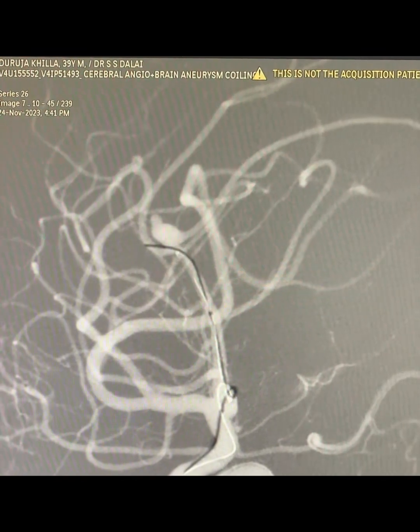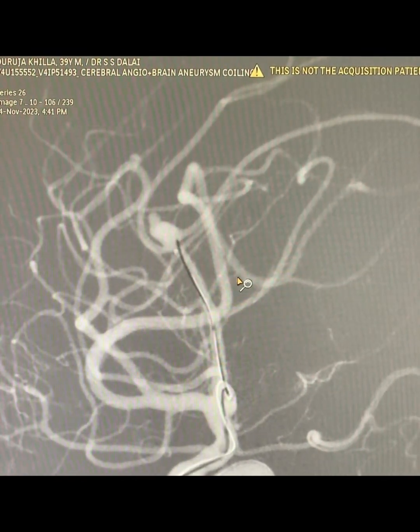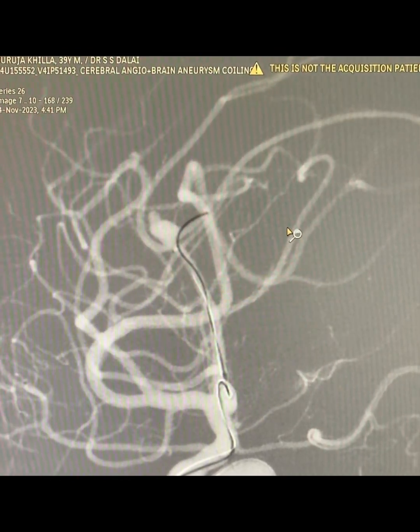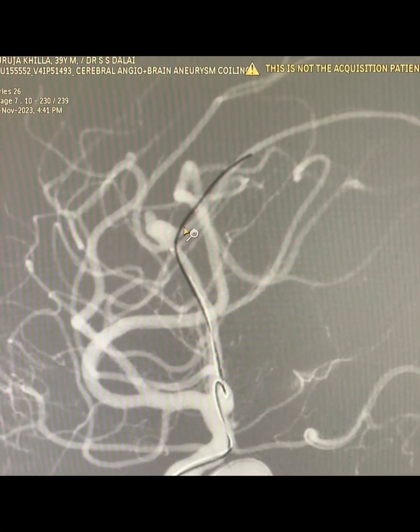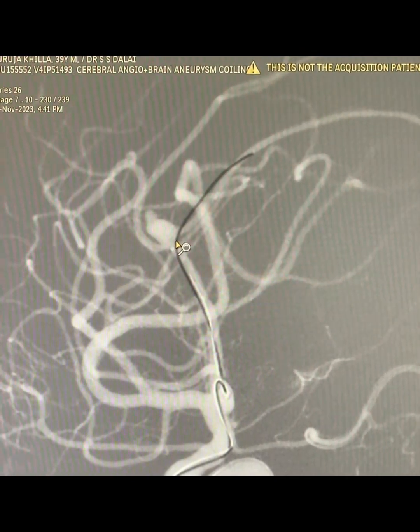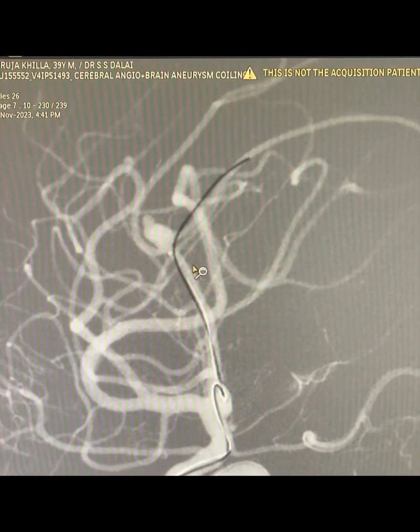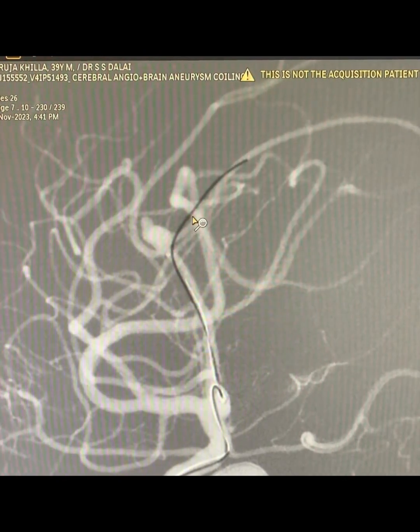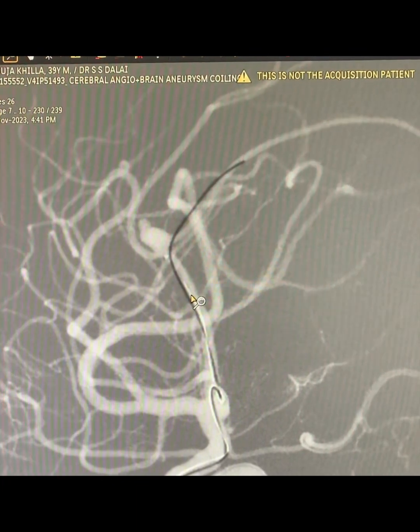So let's look at the cannulation. We're going to this branch which is not required. We will try to go here. It's very careful because you have the nipple over here. Oh yes, we could manage to go distally, and then I'm just navigating my SL10 over the synchro. I will deploy my SL10 up to here, so that when I take the stent, I can retract the whole thing. My stent can start from here across the neck of the aneurysm into the parent vessel over here.